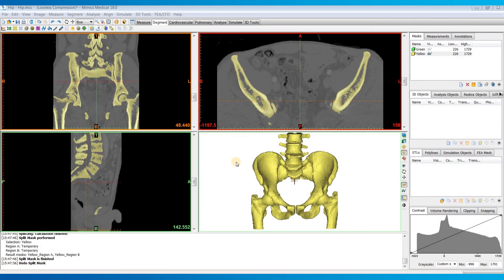Hey everyone, in this video I'll be going over the split mask tool, which is new to Mimix version 19. The split mask tool is useful when you want to separate two structures that are connected. Beforehand, you used to have to go back and break these connections manually and then do a region grow. But now with the split mask tool, we can quickly and easily separate connected structures without having to go through all of that manual effort.